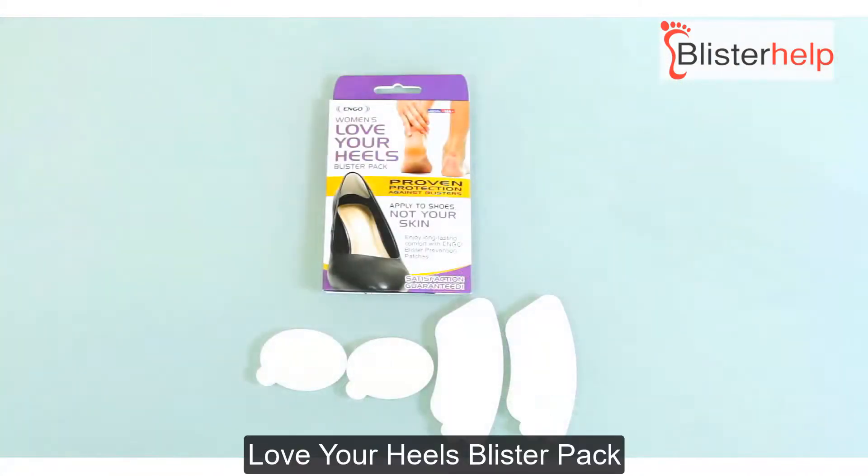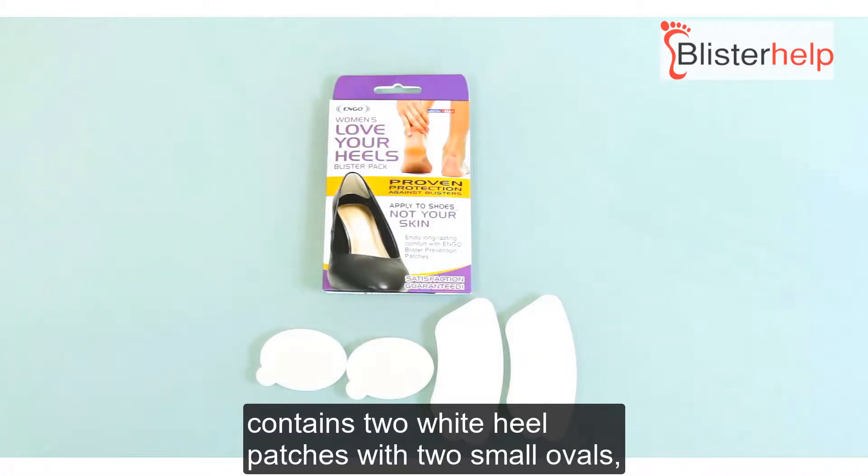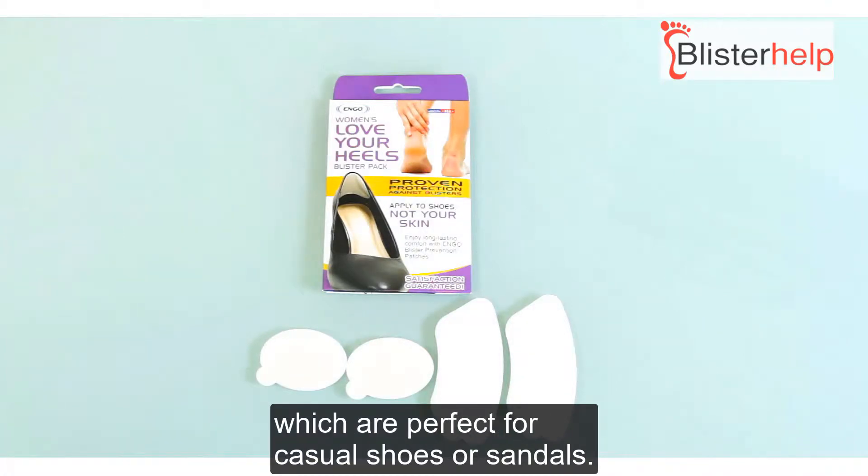The Love Your Heels Blister Pack contains two white heel patches with two small ovals, which are perfect for casual shoes or sandals.